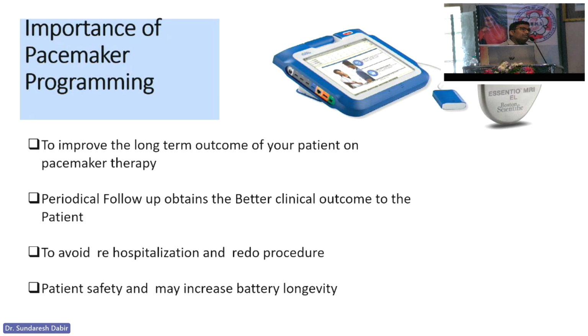If the patient is not coming to you after pacemaker implantation, it's very difficult. Whatever you have programmed, the higher voltage and all that, can drain the pacemaker battery within 5 years or 4 years, or maybe even less. During the follow-ups, we can analyze where the parameters need to be changed, and accordingly do the needful for the patient. So we can increase the battery longevity also.